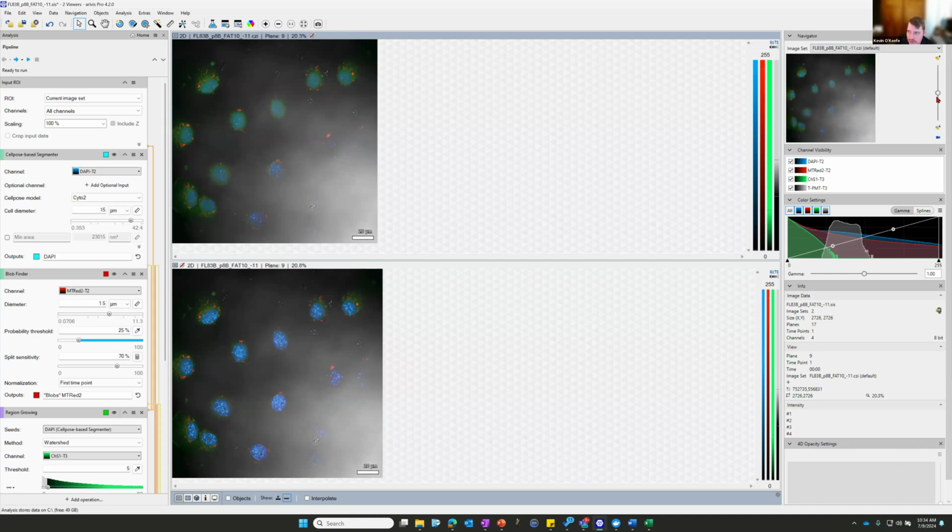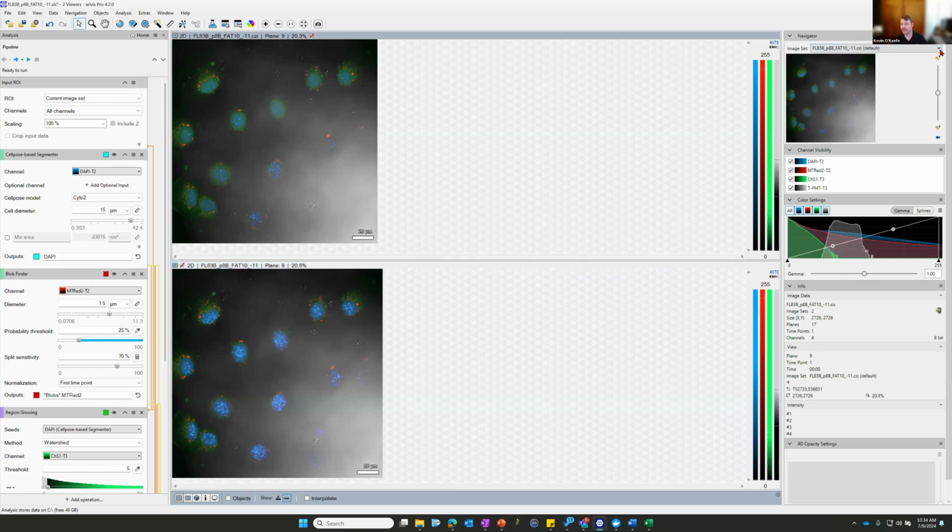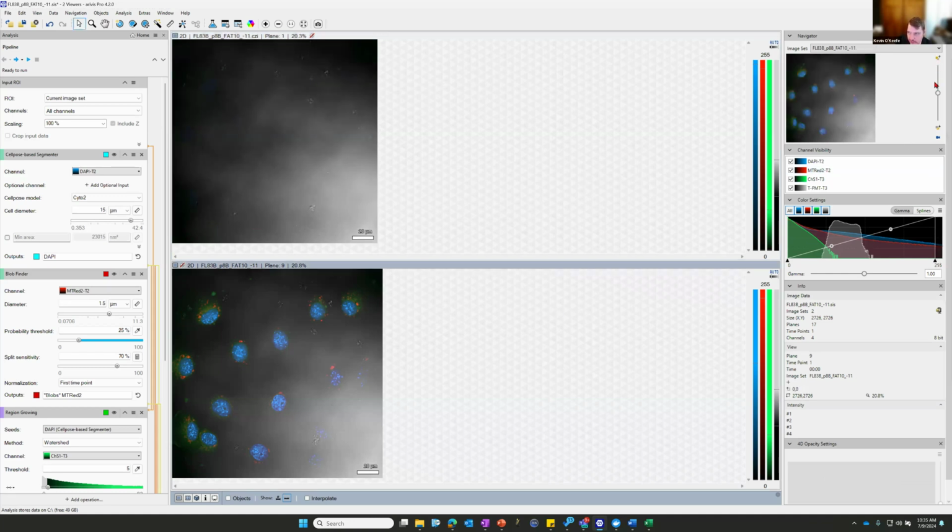There's a way we can load 2 different images, and you can look at this in 2 different views, which is what I'm doing now. So we have these 2. So we have the split view. You can change it however you want within these options here. And you can see I'm scrolling through one, click on this, can scroll through the next.